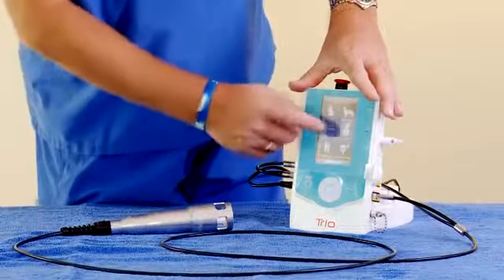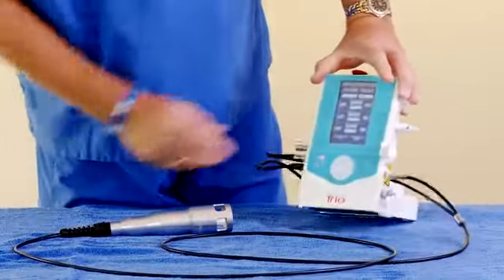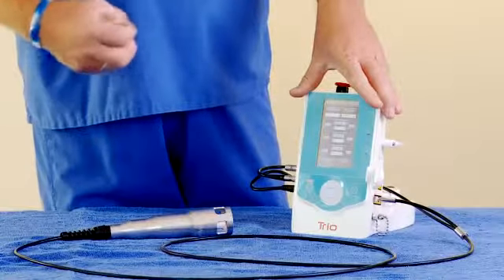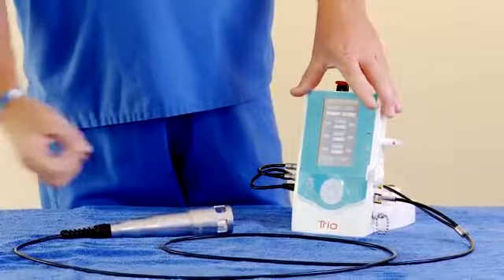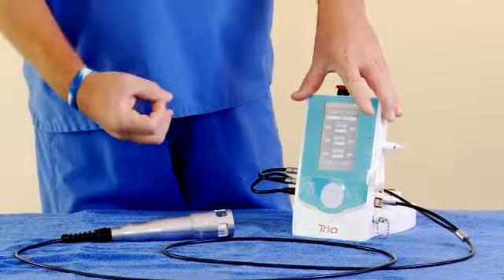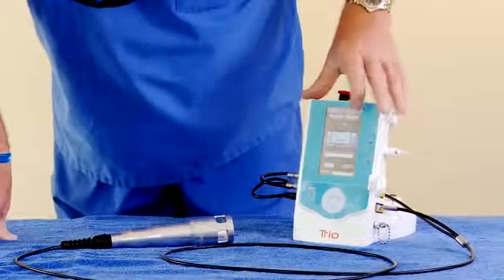If you go into settings, this is where you can adjust all your custom settings. So as you become more proficient with the laser, you can actually customize and do exactly the settings and the frequencies and hertz that you would like.